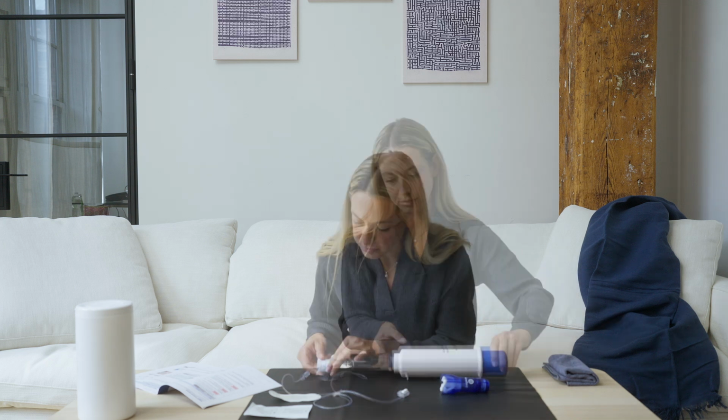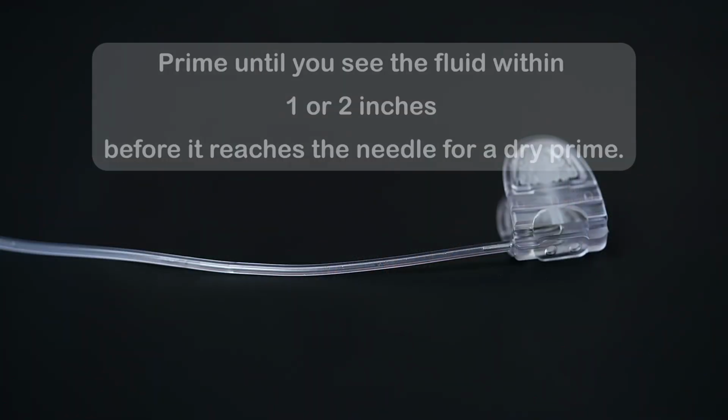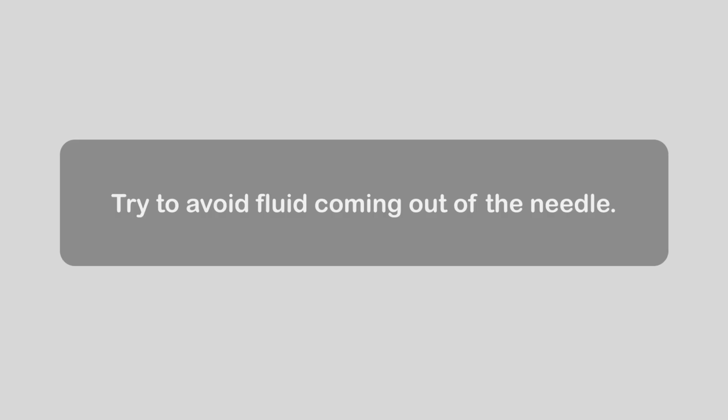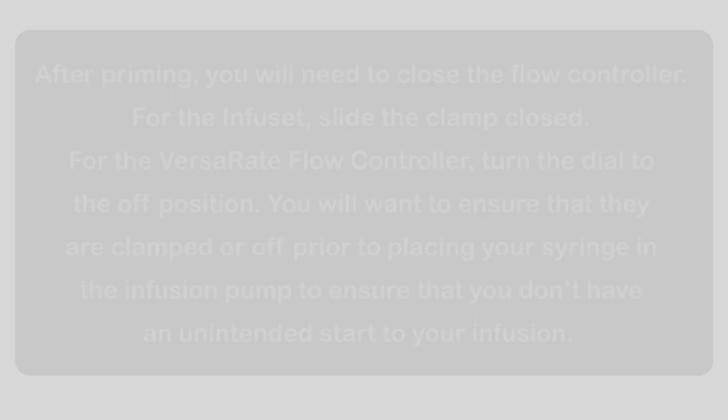It is now time to prime the tubing. Slowly open the VersaRate flow rate controller until you see the fluid within 1 or 2 inches before it reaches the needle for a dry prime. Try to avoid fluid coming out of the needle. After priming, you will need to close the flow controller. For the InfuSet, slide the clamp closed. For the VersaRate flow controller, turn the dial to the off position. You will want to ensure that they are clamped or off prior to placing your syringe in the infusion pump to ensure that you don't have an unintended start to your infusion.